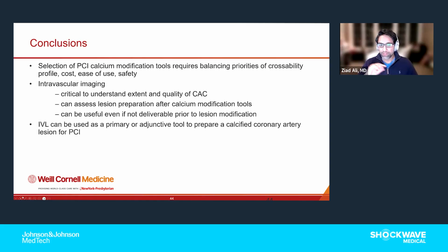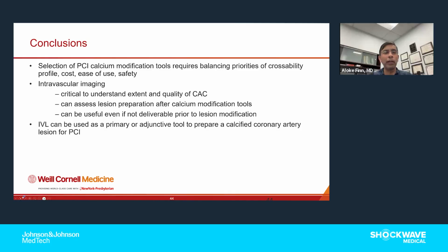Now, one unanswered question is, does IVUS miss the same amount, more or less? Nobody knows. And of course, worldwide, IVUS is a much more commonly used method than OCT for calcification. We're going to be able to look at the predictors, whether reverberation matters, whether you can actually see the fractures, and whether there is a difference in the utility of identifying fractures by OCT and IVUS. Great. It's going to be a great study, I think, once we get the data.